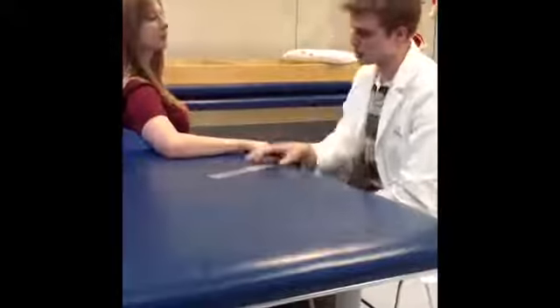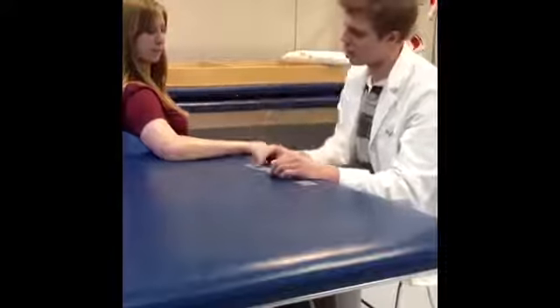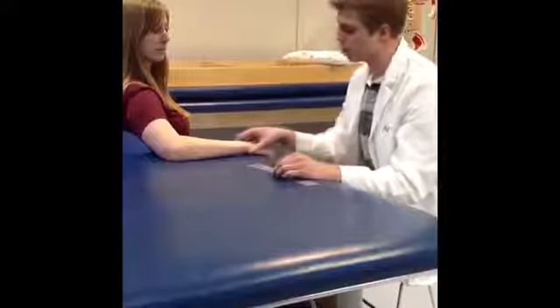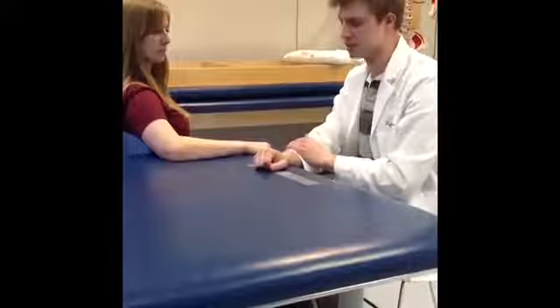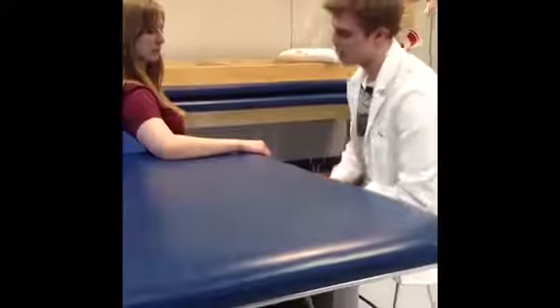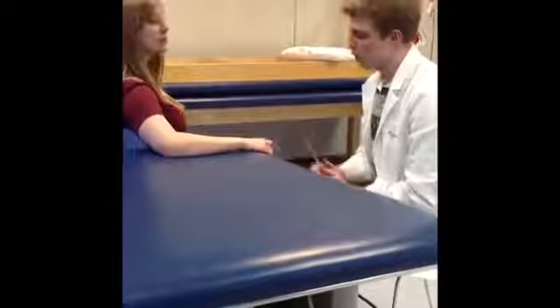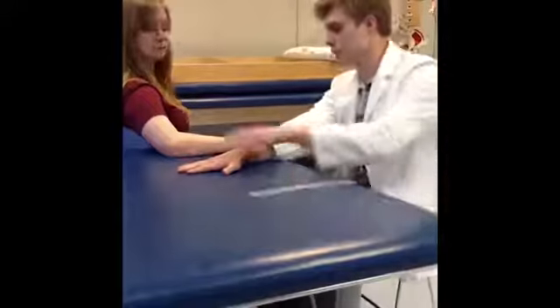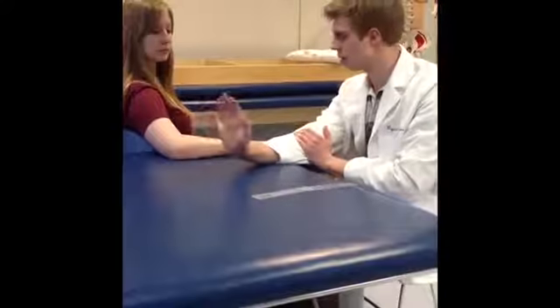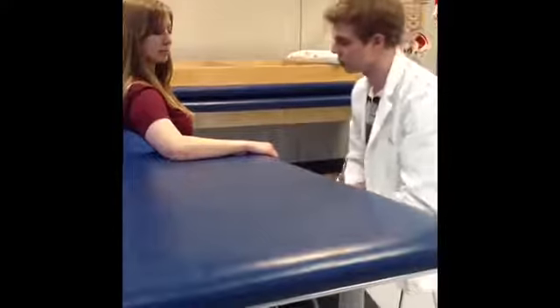The most important aspect of the patient positioning is that they have a 90 degrees of elbow flexion angle. It puts the wrist extensors in a neutral position to make sure that you have a valid measuring. Instructions to the patient would be, what I would like you to do is move your hand closer to your elbow joint like that. As demonstrated for them, I think that's a very effective means of doing so.